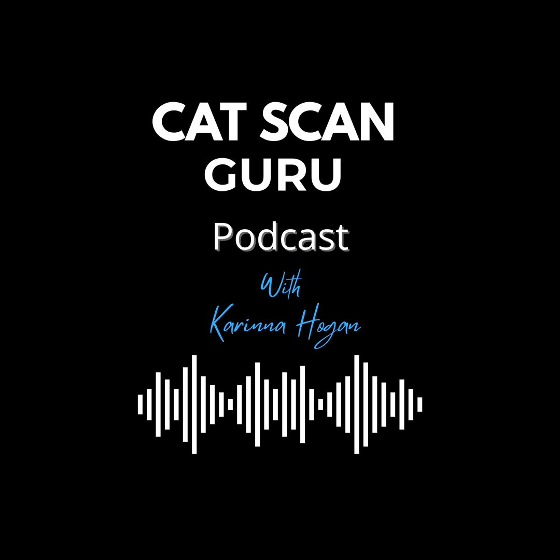I did an excellent TikTok video on patient centering, which I will link in the show notes, where I give you a visual diagram of why patient centering is crucial and why your scouts need to be properly centered. Because radiation dose is a factor, and you need to make sure that all the anatomy you need is in that field of view.